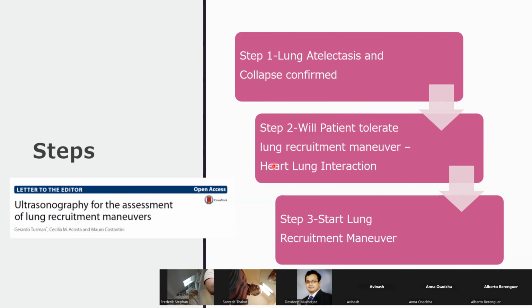And that is where I would say extremely preterm babies need to be handled very carefully. Now, a simple example that I'll give you is a baby who is desaturating in 100% oxygen, who's had surfactant. Now, that baby may be desaturating because he's got pulmonary hypertension. And you might actually end up doing a lung ultrasound which shows well aerated lungs bilaterally. And I've just recently managed a 25-weeker with exactly this situation. Completely well aerated lungs with a significant pre and post ductal saturation difference.